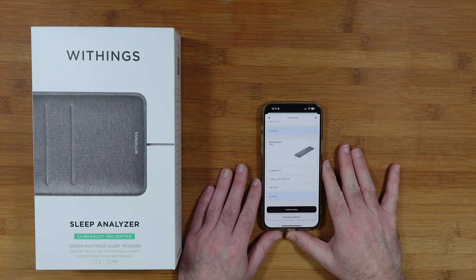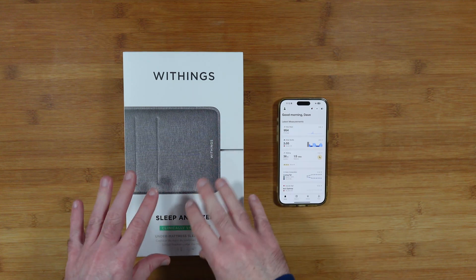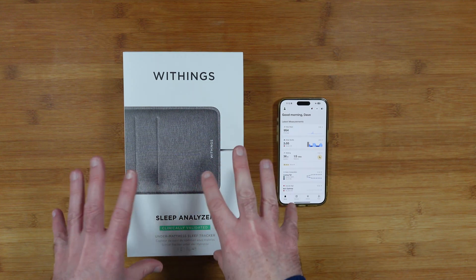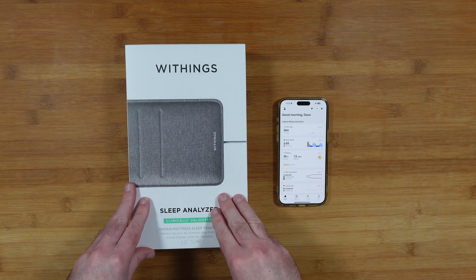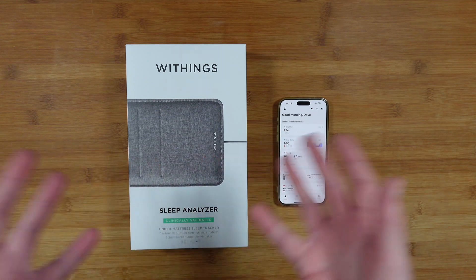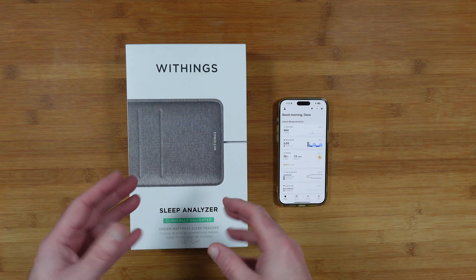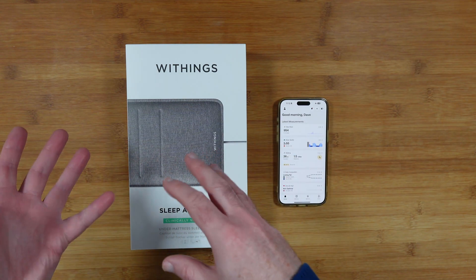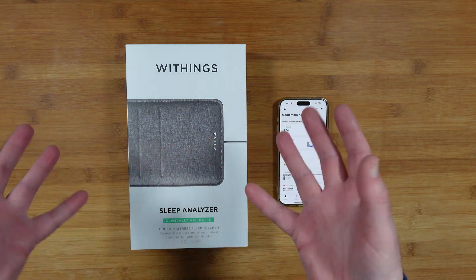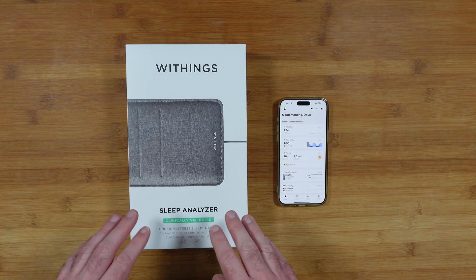I've been using this for around a week now and initially I had mixed results. Before I go into those results and show you how the data is gathered in the app, I should mention that I'm not a medical professional. If you are having issues with your sleep and health, please seek professional medical advice from your GP, hospital, or specialist consultant.